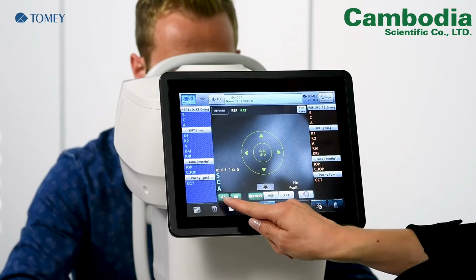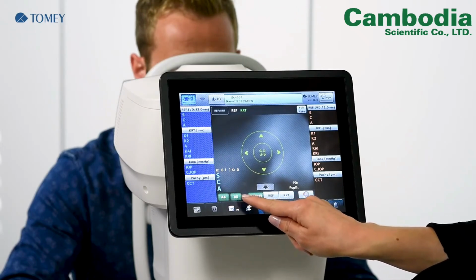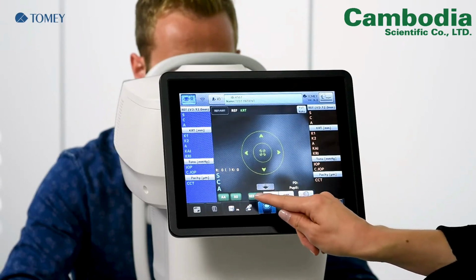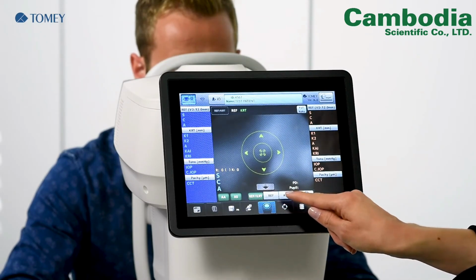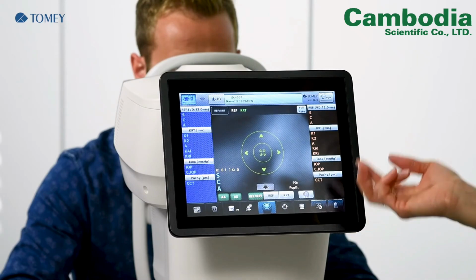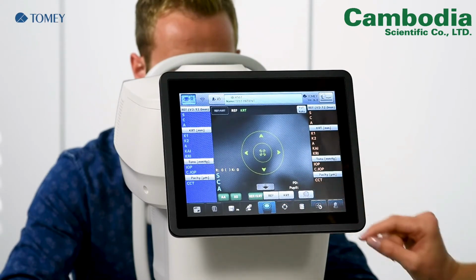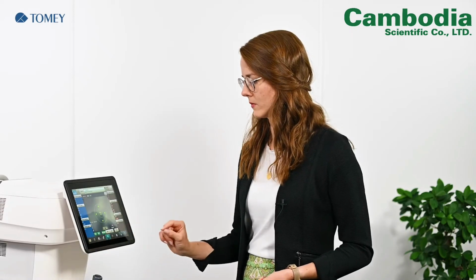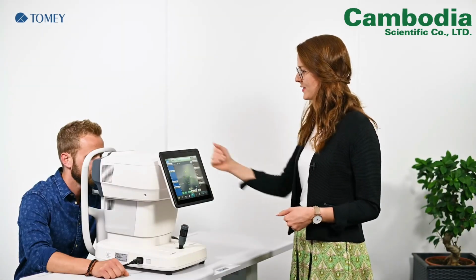And here you also see the outer alignment is on and also auto shot is on. Here you see Ref and Keratometer are taken at once. And you could also do only one of the measurements if you just activate Refraction or Keratometer, but we will do all in one. So then our patient, please come in front.